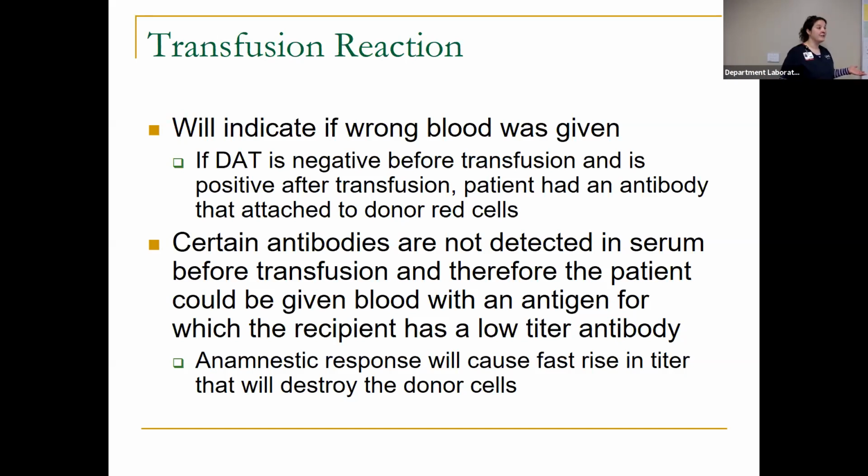Clerical error. So we're going to request a post specimen. We're going to repeat all of our testing. We're going to make sure our patient's ABO matched, pre and post. We're going to make sure the unit was labeled appropriately. We want to make sure that the mistake was not clerical on the blood bank side. Want to make sure patient identification was done at the patient bedside. All of this is documented, and we'll go through each step of that as we go through the course.